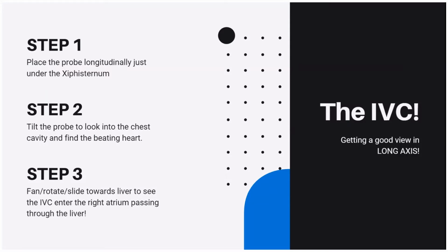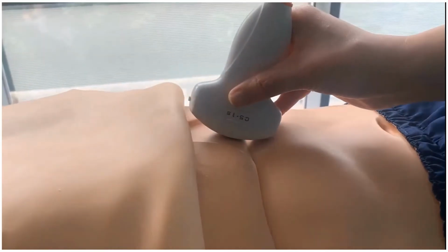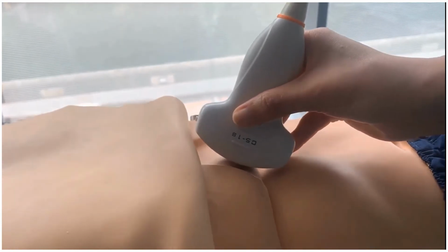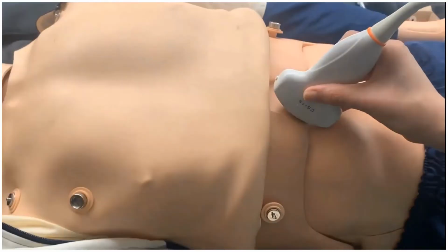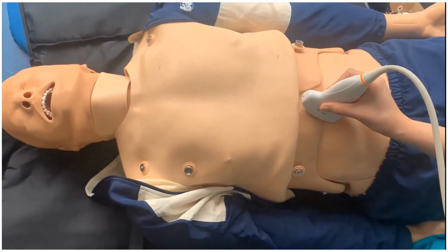Then you're going to do a combination of fanning, rotating, and sliding towards the patient's liver, that is the patient's right side, to see the IVC entering the right atrium, passing through the liver. Now, how this happens is place the probe, move it up, tilt it down, and then slide, rotate, and fan to then end up in this particular position on the patient.